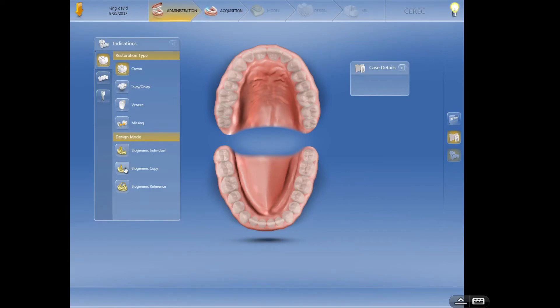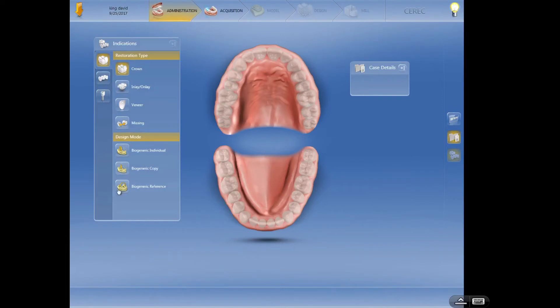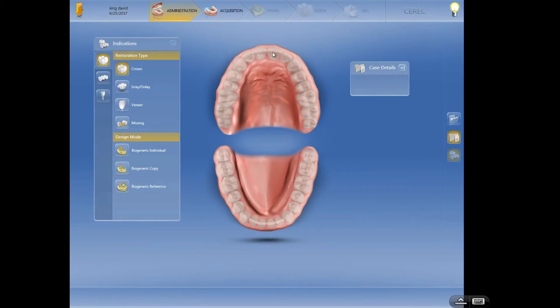So biogeneric copy, you would have to copy or take a pre-preparation image in a separate file folder in order to use this. And what's this biogeneric reference? Well, this would be where we would want, like if we were doing tooth number 8 and we wanted to replicate in a mirror what tooth number 9 looks like, or 7 and 10 or something like that, or 12 and 13, adjacent teeth.